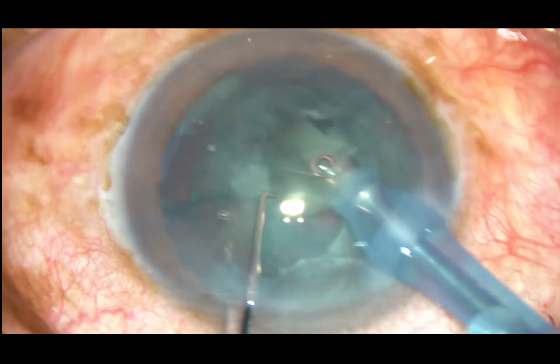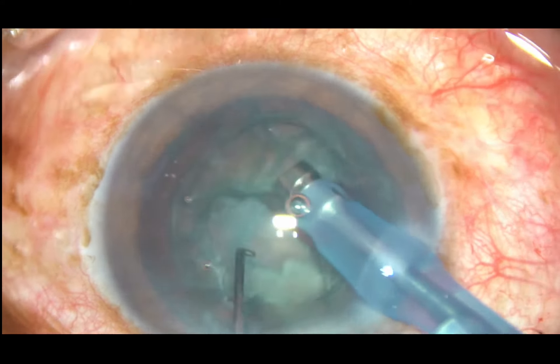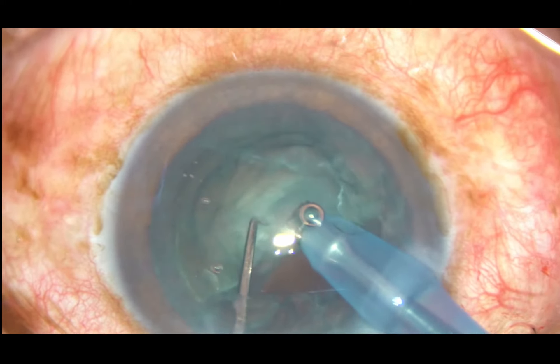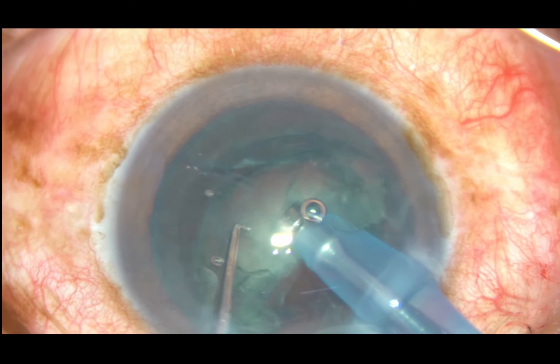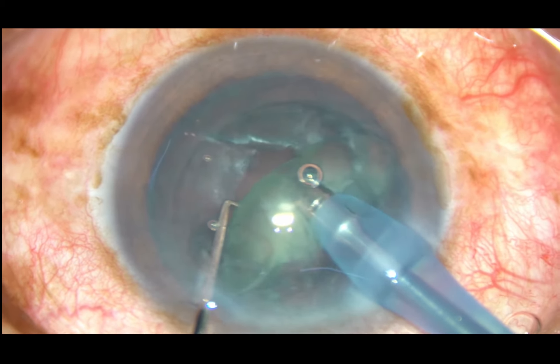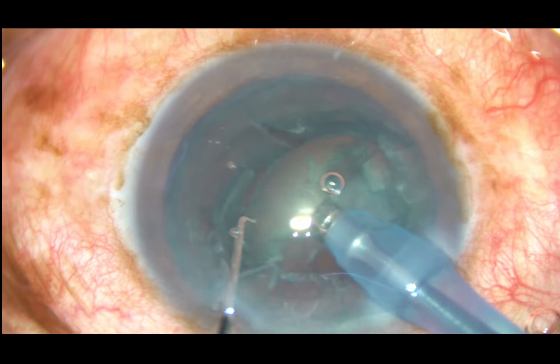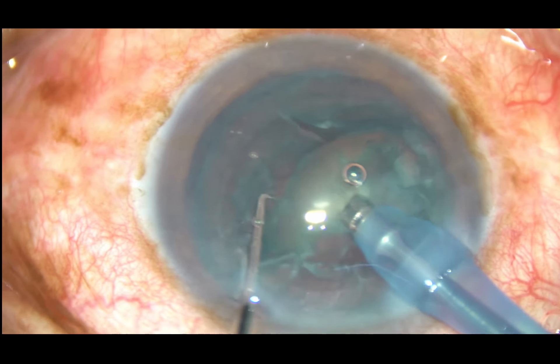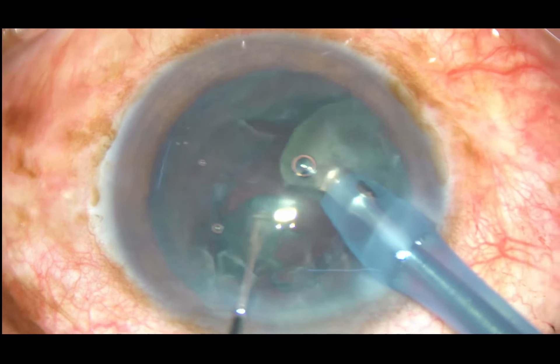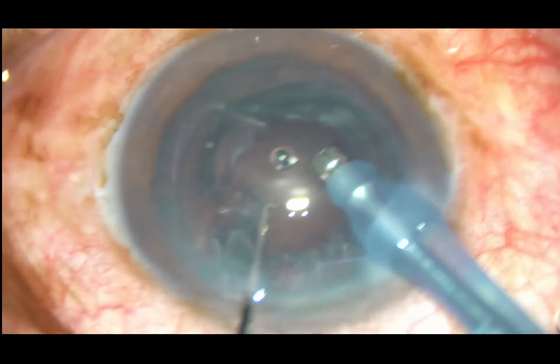Now rotate the nucleus, chop at another place, and this free nuclear fragment can be emulsified and removed. For the other hemi-nucleus, hold it at the middle with a firm grip — if you apply energy it will just cut. Just hold it and if you want to chop it, chop without applying any ultrasonic power, then emulsify and remove this base of nucleus.